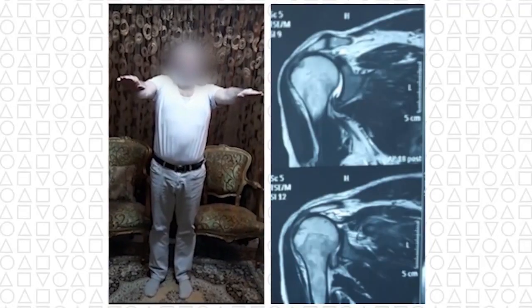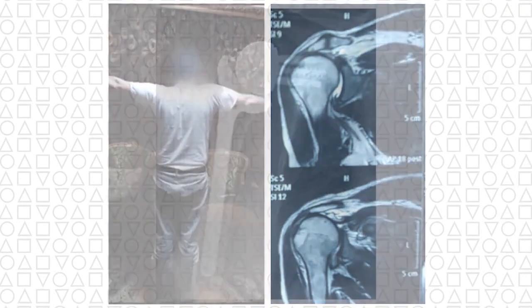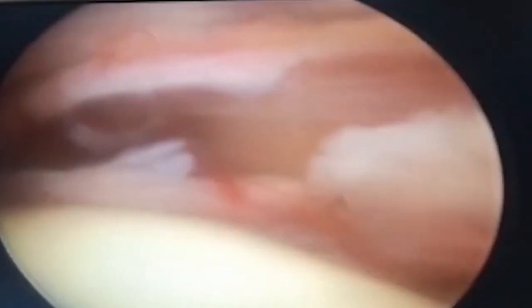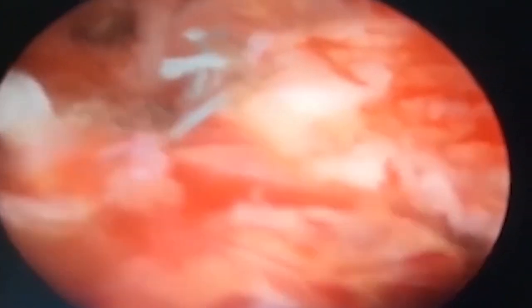This is a case of a large massive rotator cuff tear. The patient was to have a reverse total replacement. He refused that, and we did an arthroscopic surgery. The head is completely uncovered. This is after surgery, transosseous reconstruction of the rotator cuff.